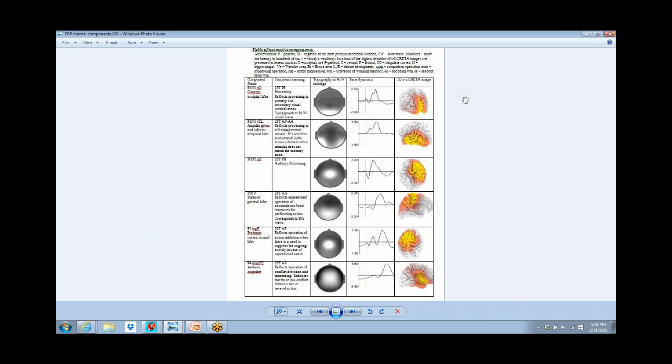The important thing is, if you are trying to test them, you have to use the exact setup. Not kind of the same, not generally the same, but precisely the same. Exactly the same interstimulus interval, the same distance from the screen, thus the radius of the image in your visual field, the same luminosity of the image, the complexity of the image. You can't have one image with more line density than the next. So all these things are controlled within the stimulus presentation here. If you alter those, you get alterations of these responses.